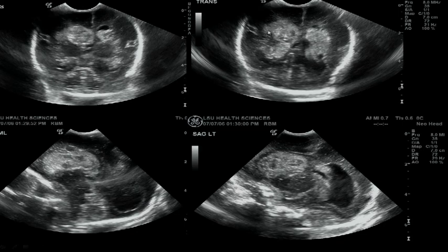But when it goes into the brain parenchyma, what are the patients going to get? Okay, that's a little different. They're going to get porencephalic cysts. Porencephalic cysts are when you bled into the brain, and now that brain parenchyma is dead, so when the clot resolves, there's going to be a cyst that will communicate with the lateral ventricle. That's a porencephalic cyst. Periventricular leukomalacia will not communicate, and that's usually due to a little bit of ischemia. And initially, it's going to be echogenic.